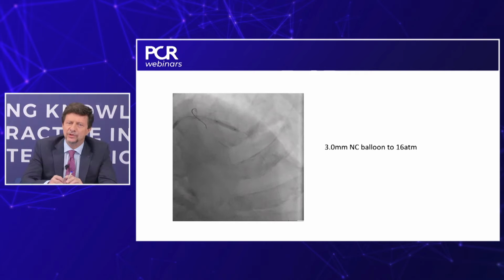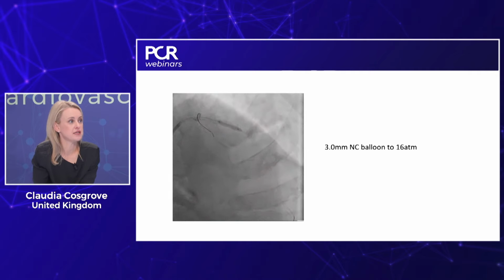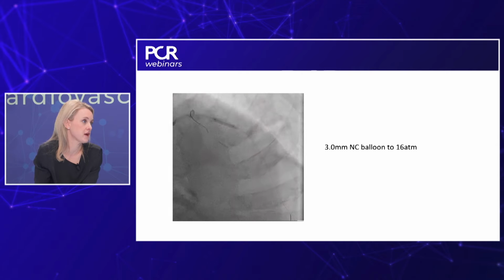Claudia, you said angiographically your evaluation of the severity of the calcium was moderate. Did this idea change after you have seen it from inside with the IVUS? Yes, I'd say I've upgraded it to a severe in that it's extensive. There are areas of nodular calcium, concentric calcium, and it's calcium that needs to be modified further. So I think, yes, on the IVUS, we'd say it's severe calcium.